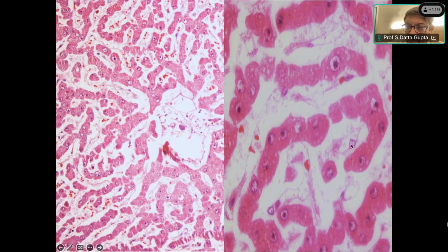You see this? This is the endothelial cell. This is the sinusoid, the space of Disse. This is the space present all around, right? And this might be a Kupffer cell, or it might be the endothelial cell. And you're finding these hepatocytes with nucleus and nucleolus, and so on. You see this, everything is separated out in the portal tract. This is all fixation artifact, but this is just to show you. Otherwise it is very difficult; unless you do an EM, you can't find the space of Disse that easily. It's all because of fixation artifact. Good, right? We'll go into that.